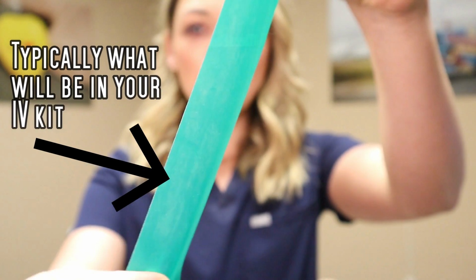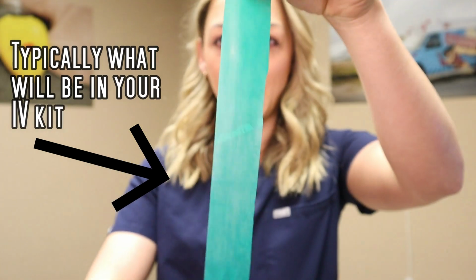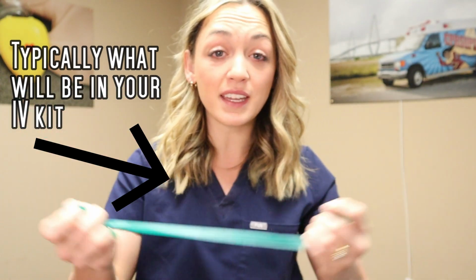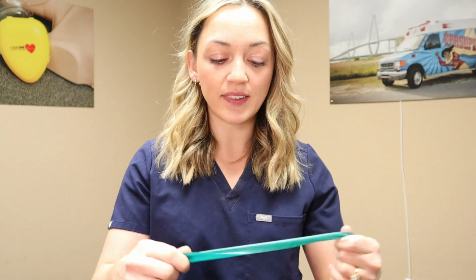Alright, today I am going to be showing this to you on a pediatric mannequin and an adult mannequin. I am using this as a tourniquet. This is normally what you will get in an IV kit, and it's the elastic band. It's not like a stop the bleed kind of tourniquet. This is simply just to get those veins pumped up so you can successfully place that IV site. First, we will start with our adult patient, then we will move to our pediatric patient.